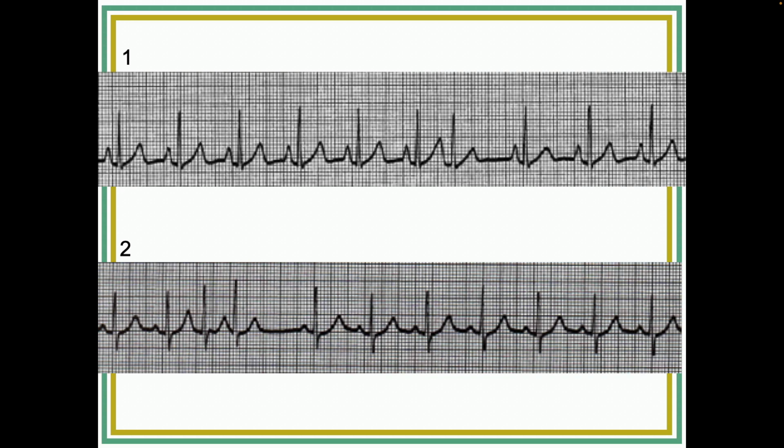And there's that premature beat. Okay, where are they? Right there. Any others? I guess the one before. Yep. So how do you know, hey Cody, how do you know if it's premature? Using your calipers, how do you know? Because the QRS complex is more narrow in those ones compared to the other ones. Say it again? R to R, there we go.